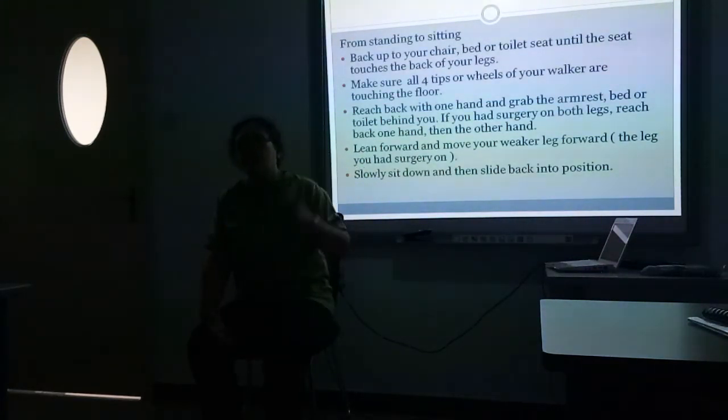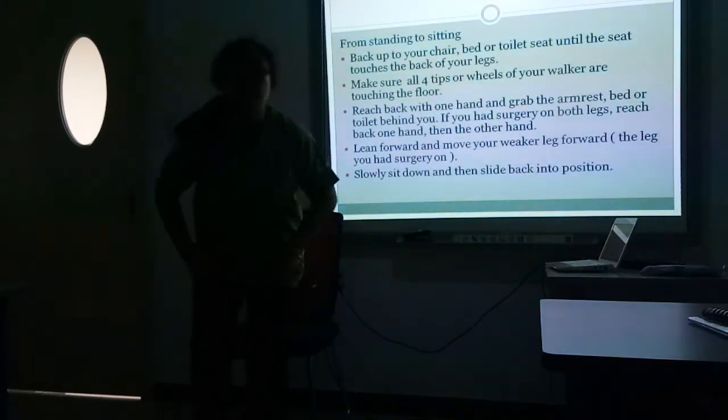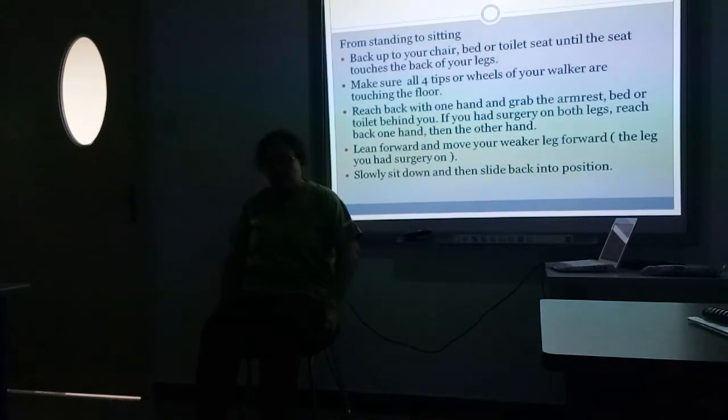Pero, for those who are elderly, na wala na sa pag-iisip, you have to, what? Instruct them. You have to teach them how to do it. Okay? Then, slowly sit down and then slide back. Okay. Hanggang doon na. Next.